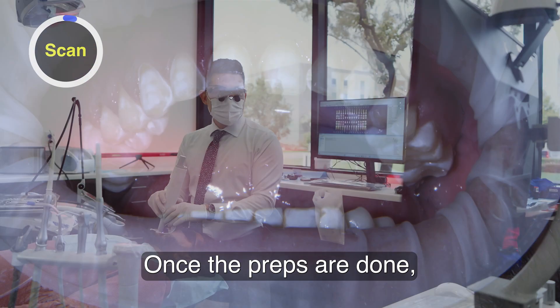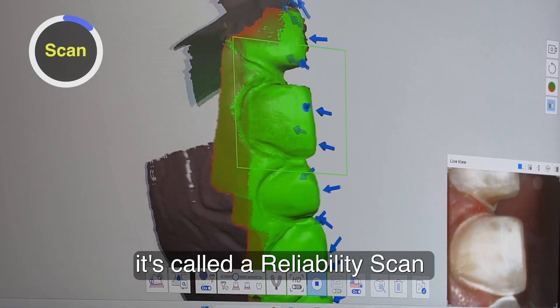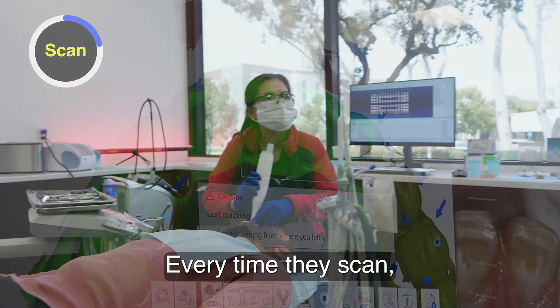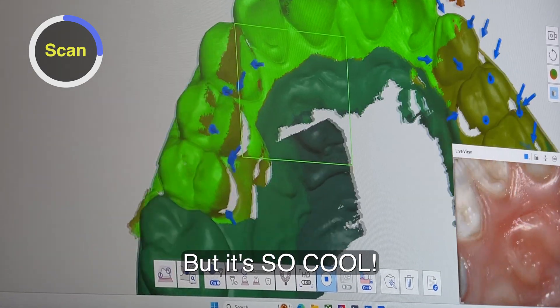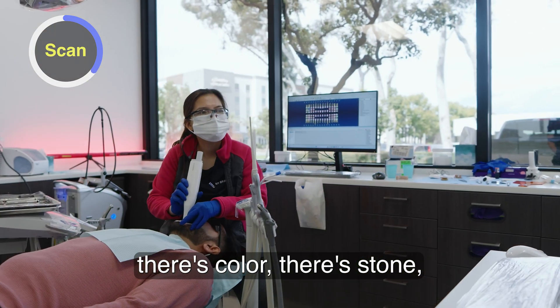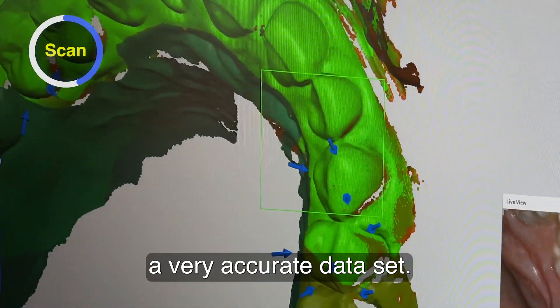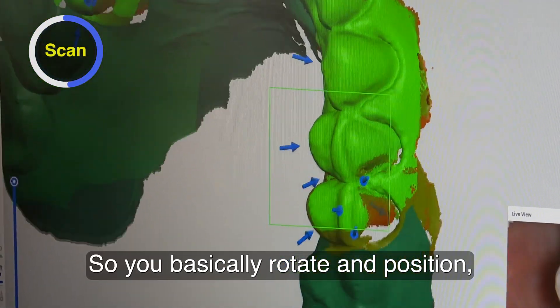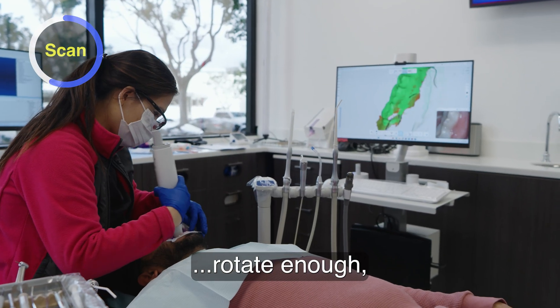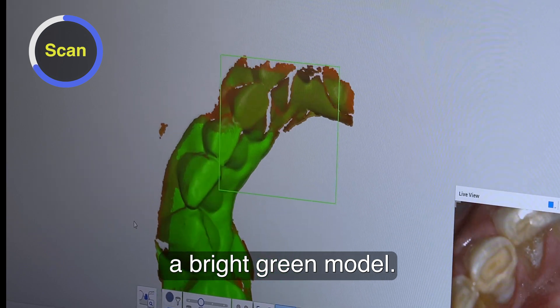Once the preps are done, using our Medit, we scan this in. This green model is called a reliability scan or reliability map. My assistants were always scanning — every time they scanned, I would see this green model and didn't really know what it was. But now I understand: whenever you use this scan, there's color, stone, and this reliability map. The bright green indicates a very accurate data set. You rotate and position — red and orange indicate low data. Keep passing over those zones and rotating enough to fill all those areas in and convert the model into a bright green model.